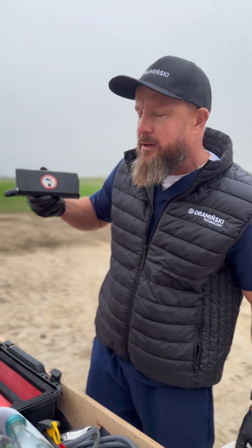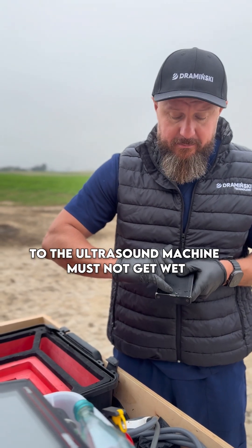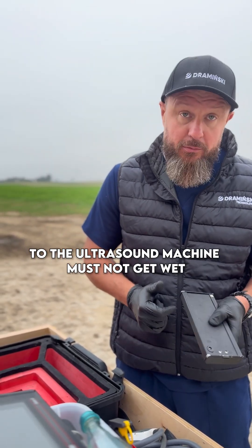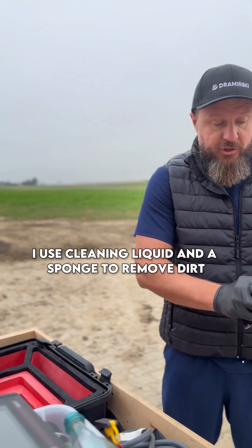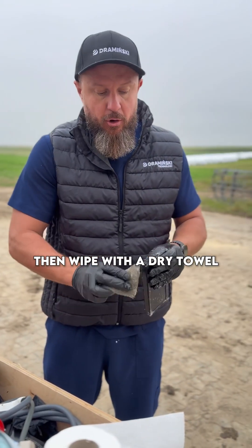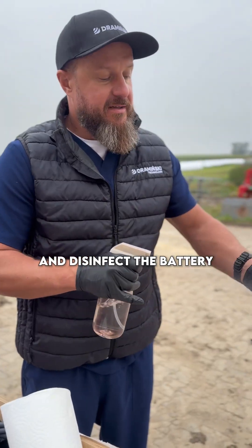Cleaning the battery. It is not waterproof. The charging port and the connector to the ultrasound machine must not get wet. I usually cover them with my finger. I use cleaning liquid and a sponge to remove dirt, then wipe with a dry towel and disinfect the battery.